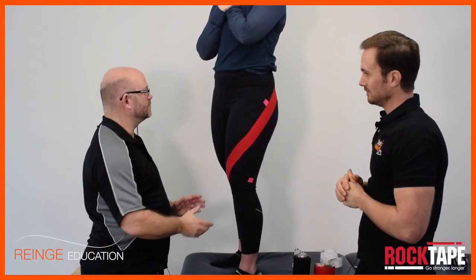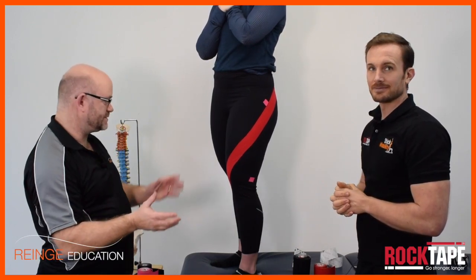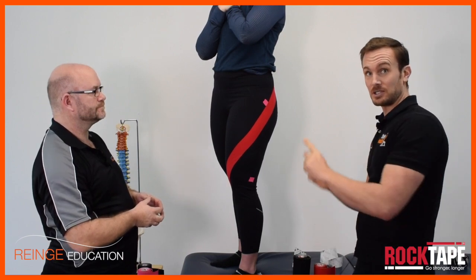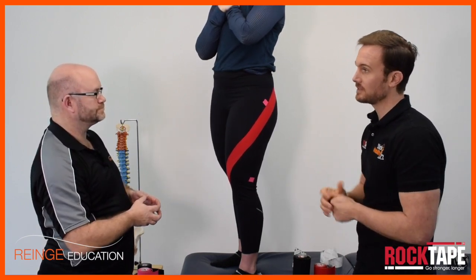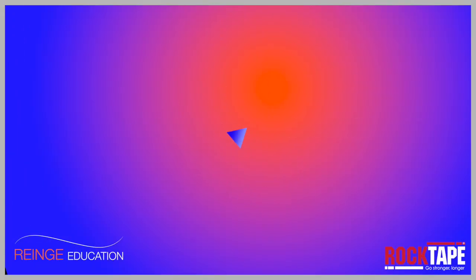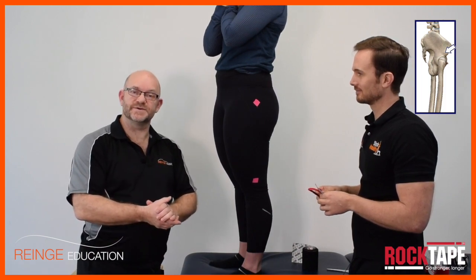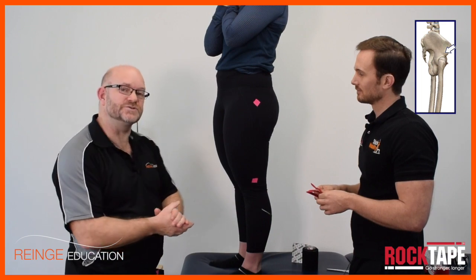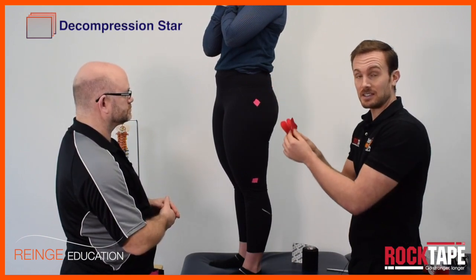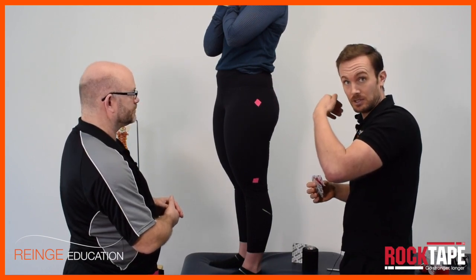If the client's leg is perfectly aligned and doesn't need the wrap, but you're worried they'll overuse that side while the other is healing, can you just put the wide decompression tape on by itself? Absolutely — that's a good opportunity to show a decompression on its own. We'll use the five-centimeter tape to show a decompressive technique that can be really useful for sore areas. This is a decompression star — effectively if you're dealing with a painful area and just looking for pain relief, this is a useful technique, and you might want to use it after hands-on treatment to perpetuate and continue the pain relief achieved in session.